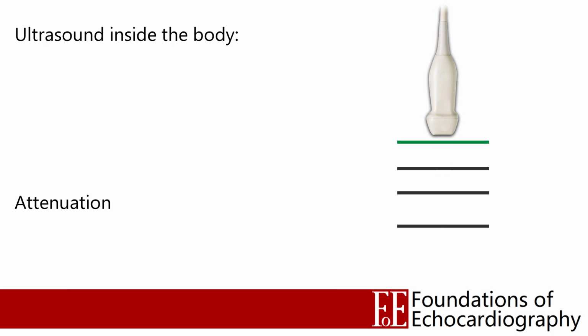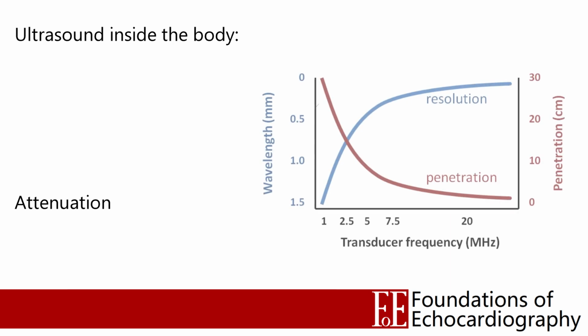Another key concept to understand is that the rates of attenuation are related to wavelength. Waves of a higher frequency, and therefore a smaller wavelength, suffer attenuation at a faster rate.